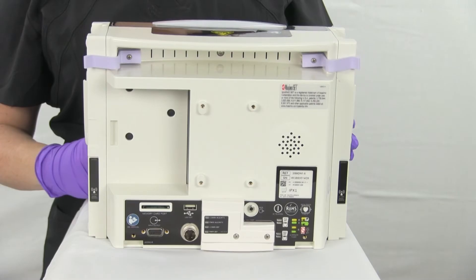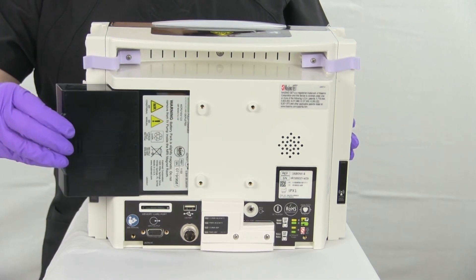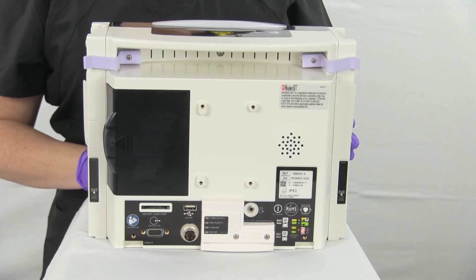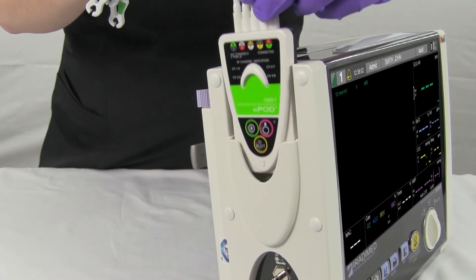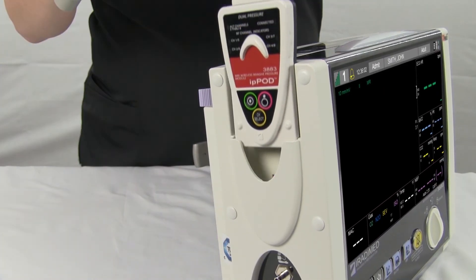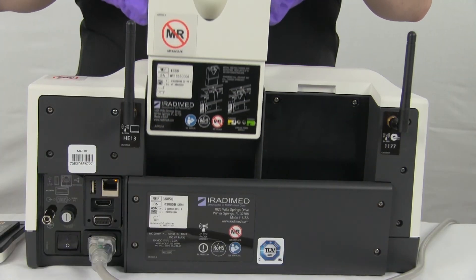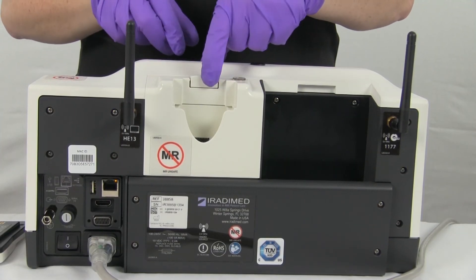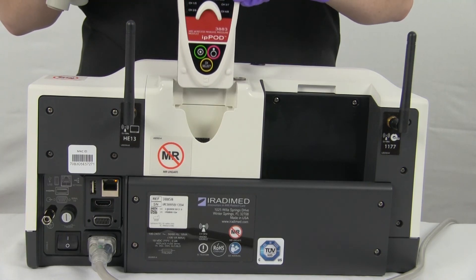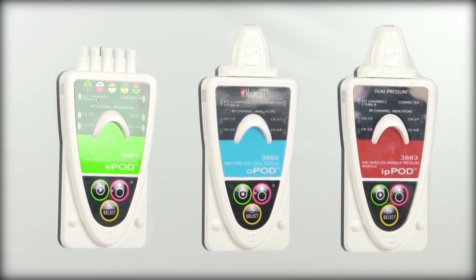To insert the 3880 monitor's battery, line it up to the battery slot on the reverse side. Push in and secure the battery — when the user hears a click, the battery is locked in place. The ECG, SpO2, and invasive blood pressure pods can all be charged on the 3880's docking stations located on the left and right sides of the monitor. Additionally, a charging dock can be added to the control room base station on the reverse side. Simply line up the pod to the slot and gently insert the pod into the docking station. Pods can hold their charge for up to 12 hours with typical use.